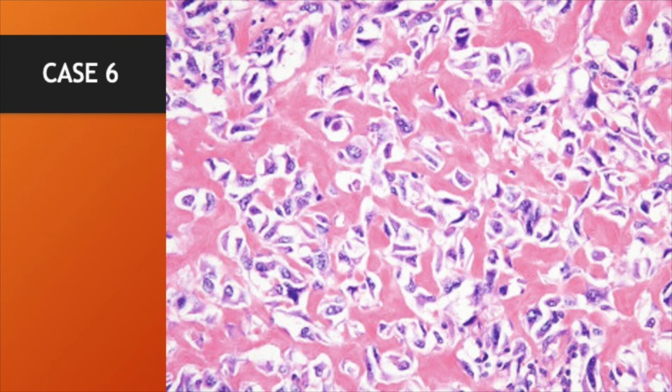When you see it percolating in between lots of cells, and lots of it, and it's very thin in appearance, we're talking about lace-like osteoid here. This is not islands like you would normally see in fibrous dysplasia, which are much larger portions than this, and it doesn't infiltrate through the cells such as this, where the cells just kind of line up around it.